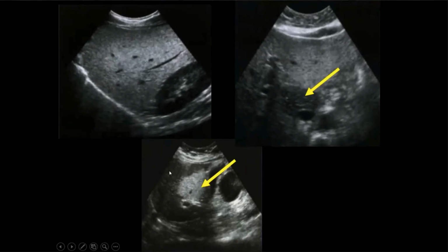And this, on the other hand, is a pretty normal liver, so you would expect it to be the same echogenicity as the kidney, and then you have this area of fatty infiltrate. Now, can I necessarily say that's fatty infiltrate and not some kind of bad tumor? No, I probably wouldn't be sure, and I would make sure I got somebody else to take a look at this. But one of the things you'll notice is that it doesn't have nice firm borders. It's kind of messy.